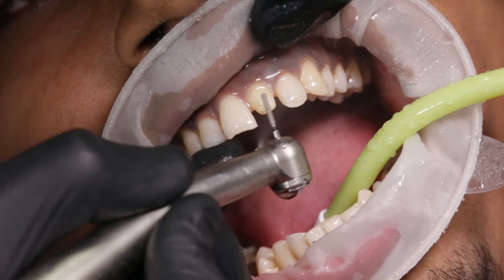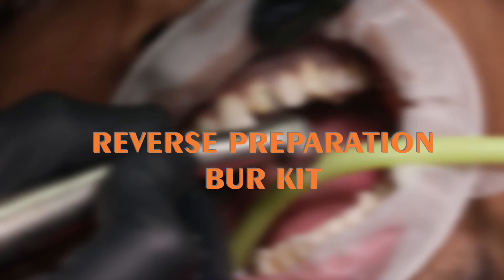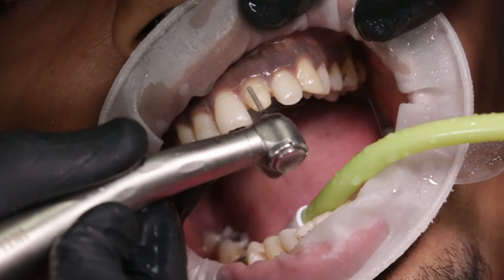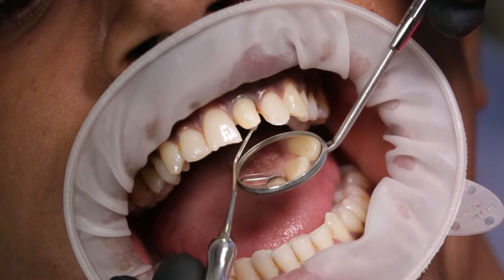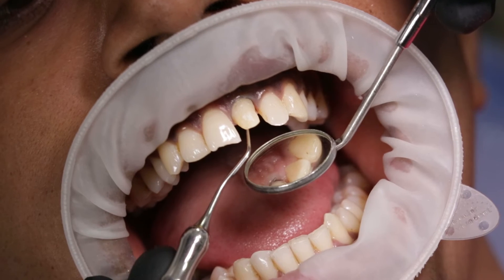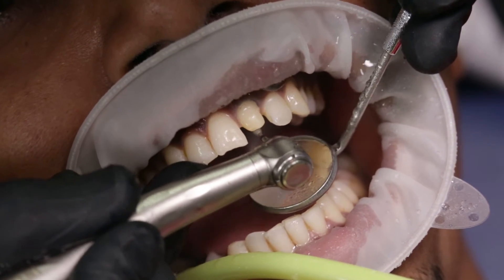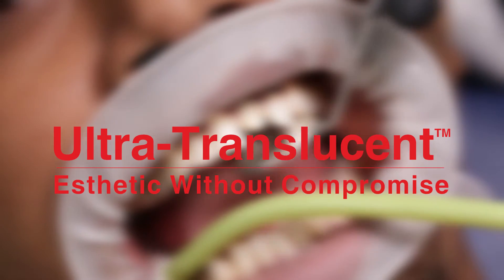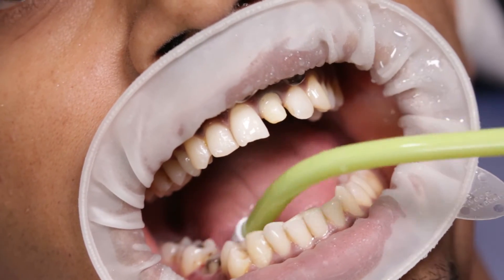I want to be as conservative as possible for refining the prep, using burs from the reverse preparation bur kit which is easily available with Chairside. This is the shaping bur S12 which I am using here. Once this is done I will first pack in the triple zero retraction cord so that I can work on the margins. I can then use the FB21 from the kit to refine the palatal preparation as well. Since I am planning an ultra-translucent crown, which is a layered zirconia from Illusion, I need at least 1.5mm clearance on the palatal surface.